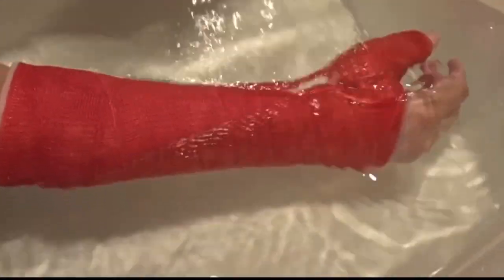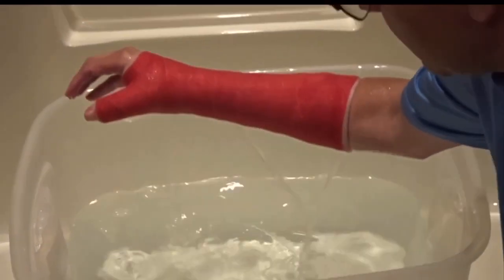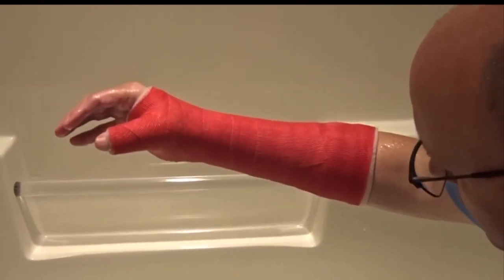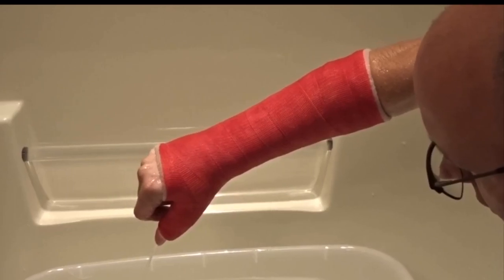So I'm going to show you how it works and then show you how to dry it. Here I am fully submerging in water, just like it would be if you went swimming, and you can see it dripping out as it leaks out of the cast.